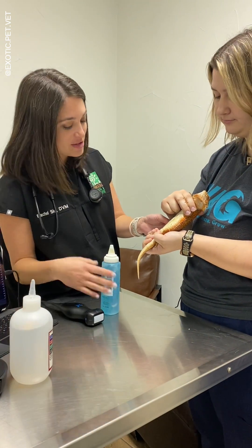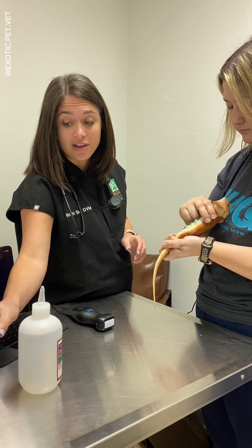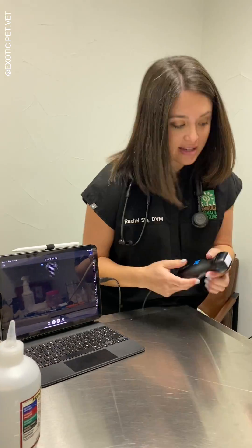Here I am using a Butterfly IQ portable ultrasound to assess for follicles in a bearded dragon. I really enjoy using the Butterfly Pro because I can attach it to my iPad and bring it anywhere. The entire machine fits within the palm of my hand, yet it does not sacrifice quality.